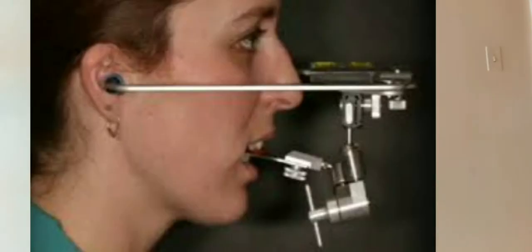So more than anything, with this third appointment, with the wax block, the most important thing is for you to know which equipment and material you have to get ready for your dentist. Okay, so that would be your wax blocks, your wax knife. You'll have to place warm water into your flexible mixing bowl. Some practices will use torches. Then you'll get your Willis gauge for your dentist to mark the jaw relation, and sometimes your face bow plate, as well as floss for your dentist to mark the appropriate areas on the wax blocks. So more than anything, I'd like to emphasize knowing which equipment and material you have to get ready for your dentist.